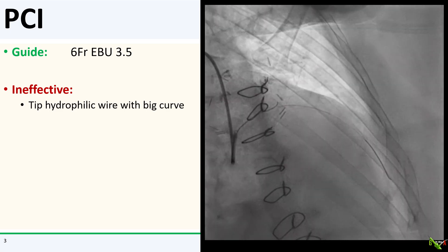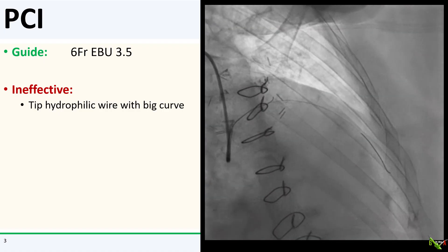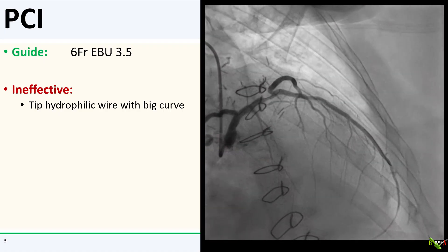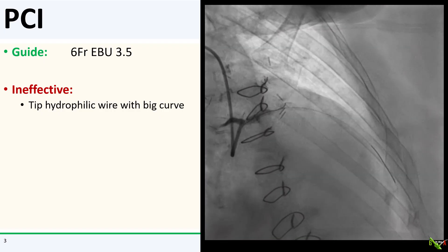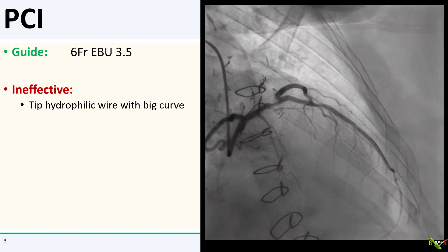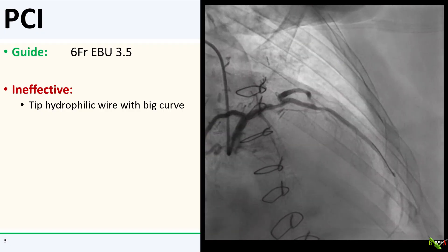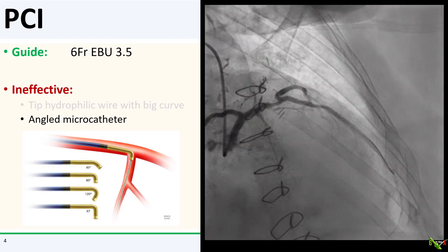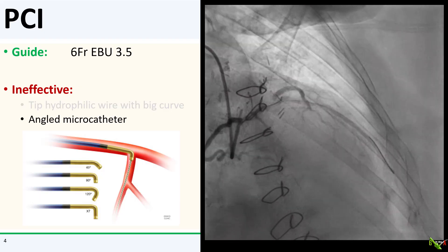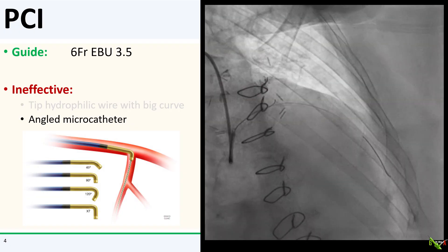I engaged the left main with an EBU 3.5 and wired the LAD with a BMW wire. I then tried my usual bag of tricks for wiring difficult side branches. First, a hydrophilic wire with a sharply curved tip — this was not effective; I could not engage the diagonal. That LAD lesion just kept getting in the way. The other tricks really didn't work either. The super cross-angle microcatheter, which often works well, was not effective in this case.